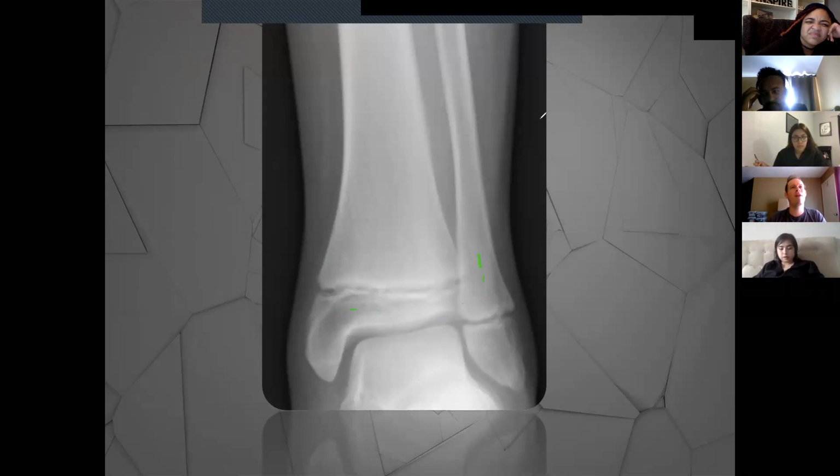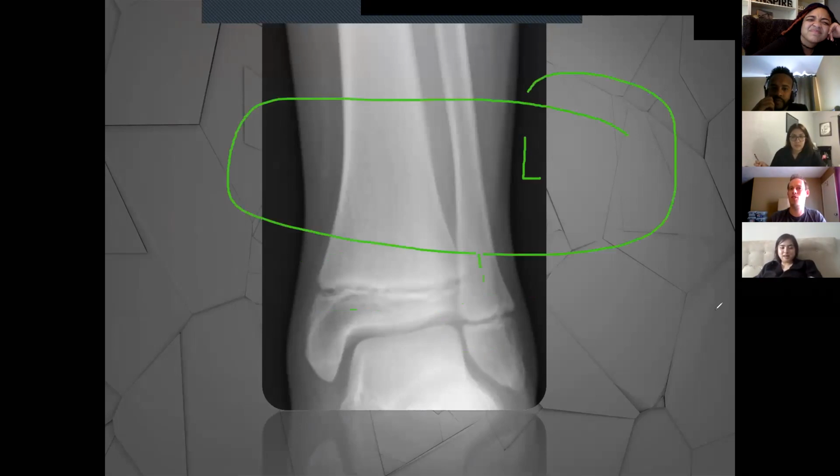And Tracy, I'm going to point it out before you do this time. Yeah, there's no marker there. That's why you have to put those markers, guys. You get used to doing those annotations, you'll end up sending an x-ray that looks just like this with no marker, and then that radiologist is going to call you on the phone and curse you out because you didn't mark it. So don't make that bad habit.